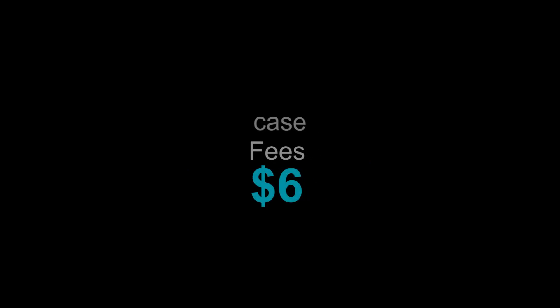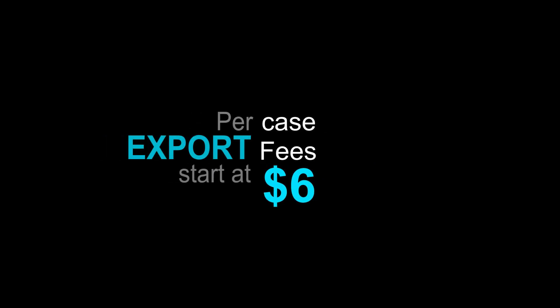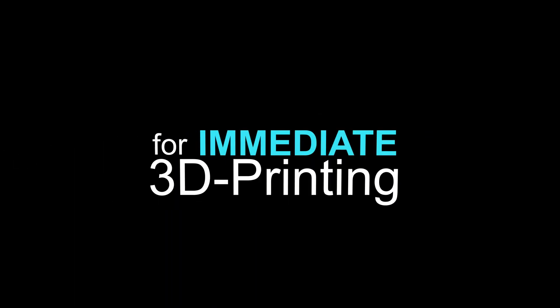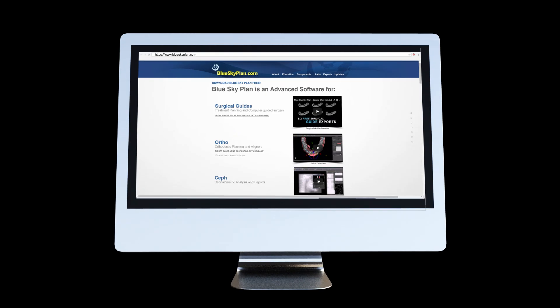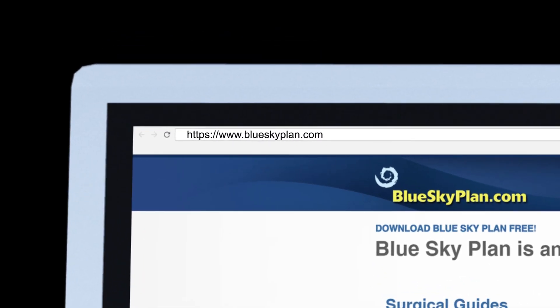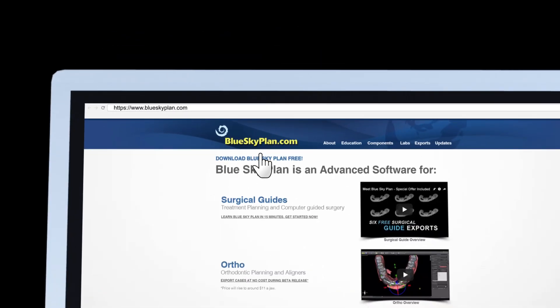Per case, export fees start at $6 to export all the relevant STL files from the software for immediate 3D printing. Download Blue Sky Plan with the new orthodontic module from blueskyplan.com now.